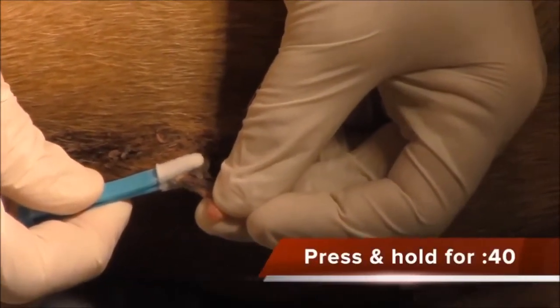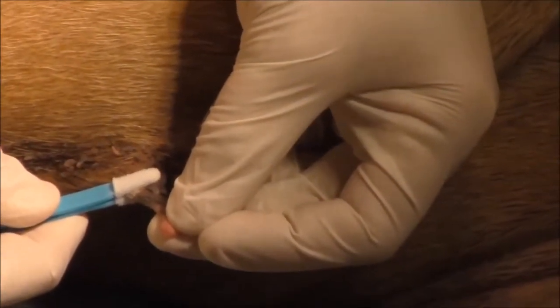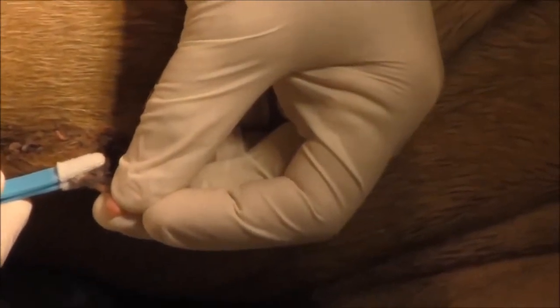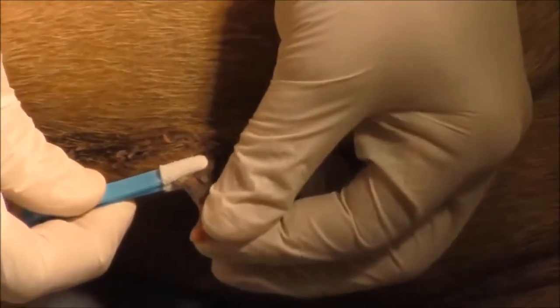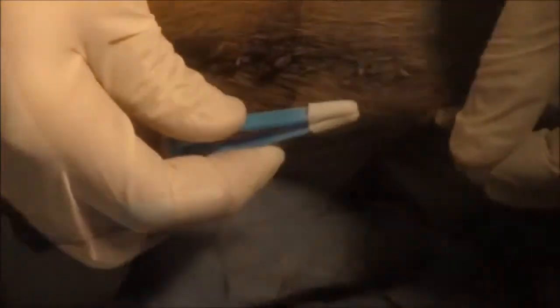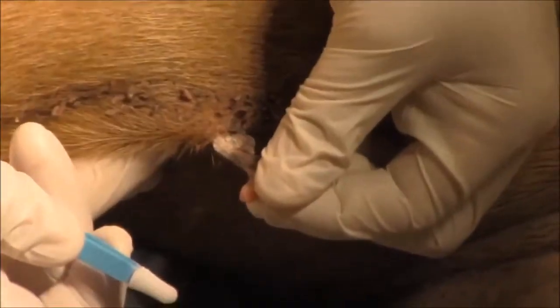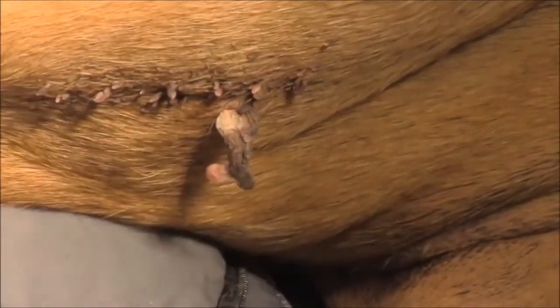We're going to hold it for about 40 seconds. There's a small guide that comes with the product that tells you how long to hold the tweezers or whatever instrument you use to remove a skin tag, mole, or wart. I just hold it on there until it freezes. You can see right here on the edge how that tissue is kind of dead and frozen up. I missed a little area so I'm going to do it again.